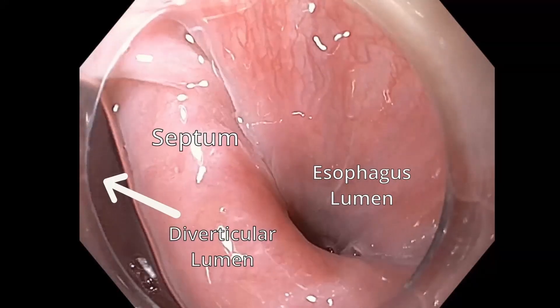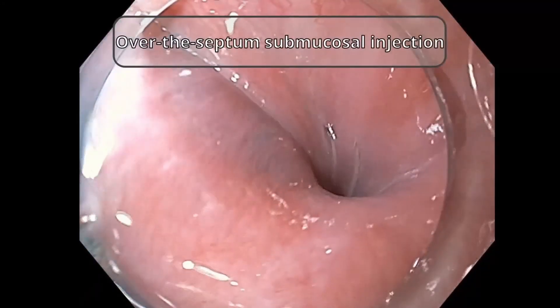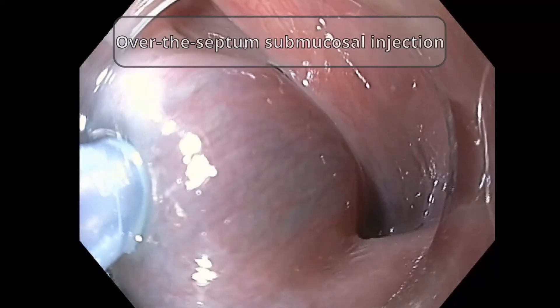Initially, similar to the modified over-the-septum ZPOEM, submucosal injection is performed over the septum, specifically at the posterior aspect of the septum.